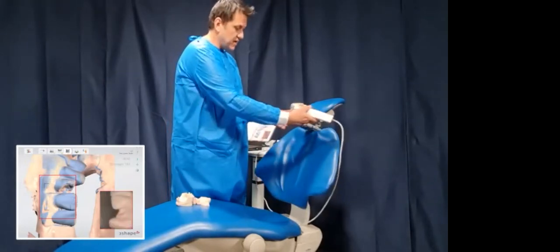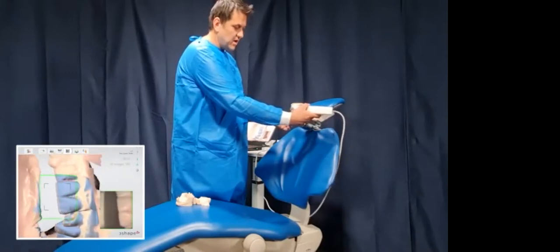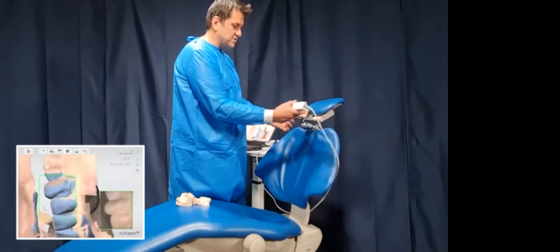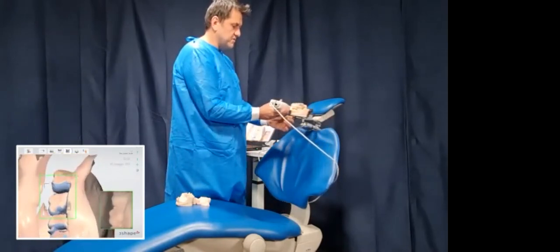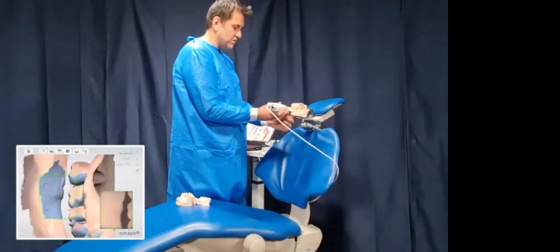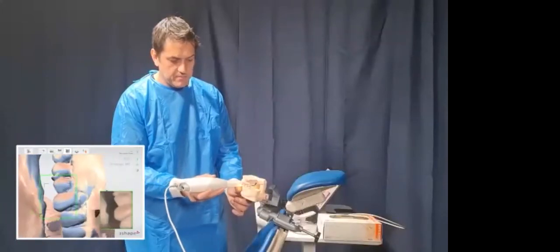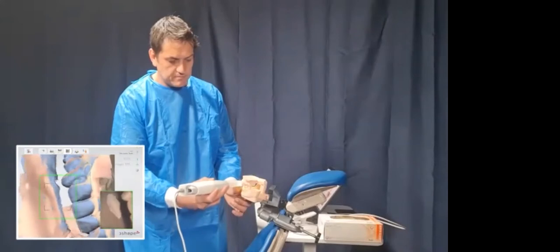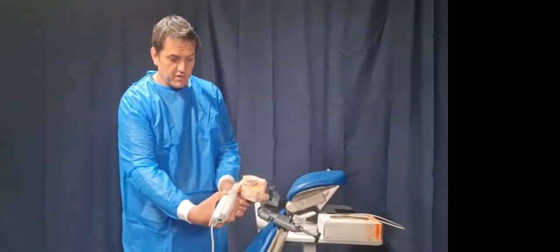So what I do then is I come back and I try to find a relocation point, which I've done straight away, which is good. And again, I just keep coming along the natural teeth until I get down to the posteriors. Now what I do now is I come back toward the midline. I actually start to roll my scanner downward. So I'm recording the teeth and I'm rolling it downward.